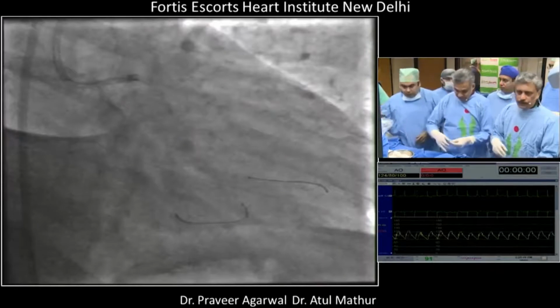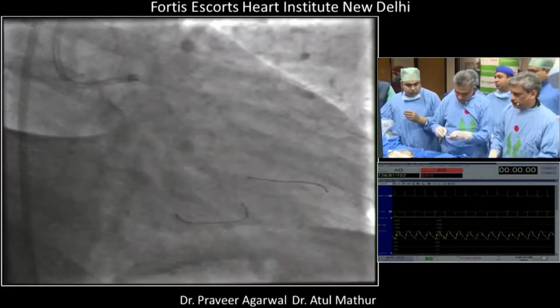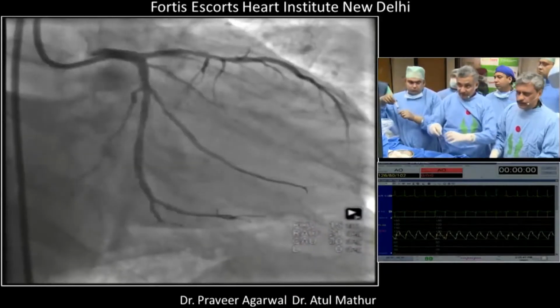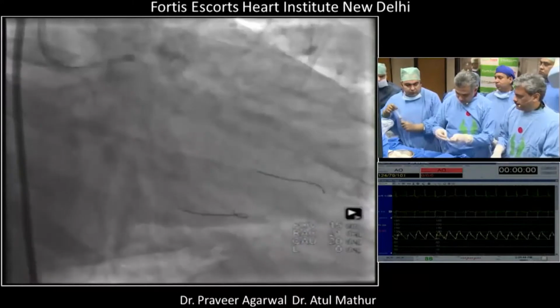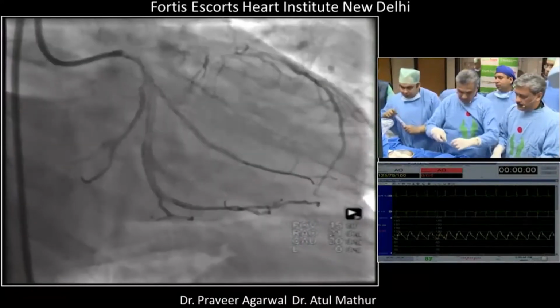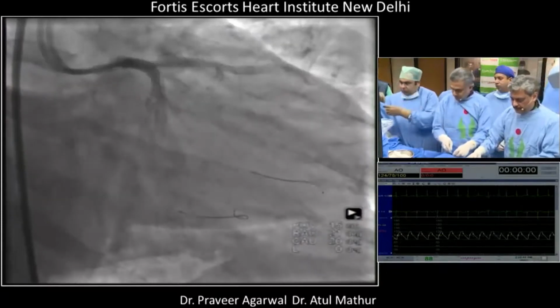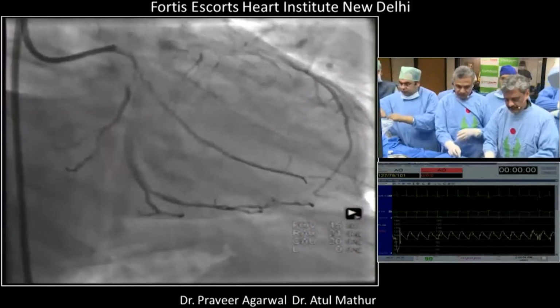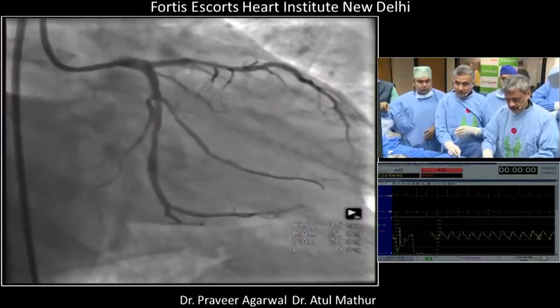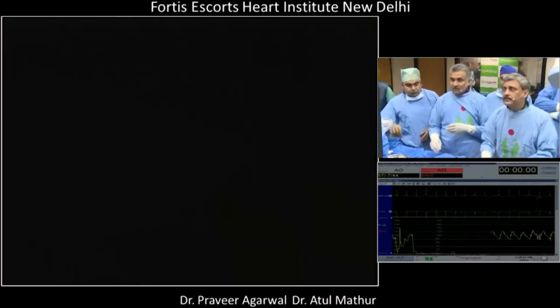So basically, we know what we are dealing with. It's not calcium, it's fibrotic, you know. So we are not pushing too hard for an angiosculpt now. This is a bend again, so I'll start first and let's try and treat it. We've got an angiosculpt 2.5. I thought you tried that. No, that was a 3.0 cutting balloon.